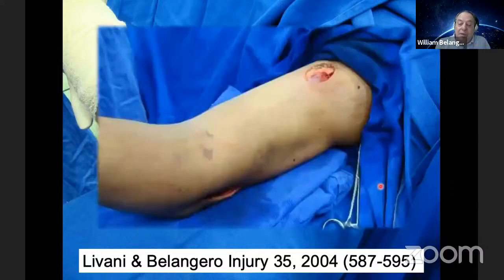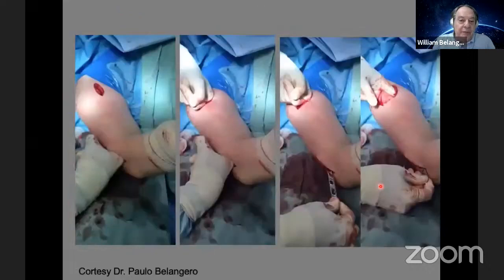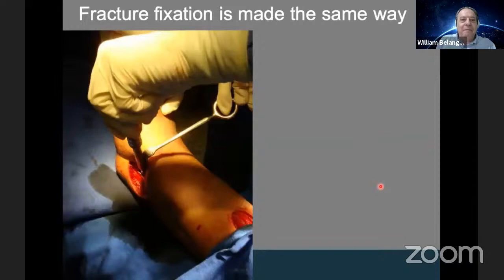This is the proximal approach, it's a conventional approach. The plate is introduced always from distal to proximal. Here. And you can use your finger to verify the safety of the humeral tunnel. This is a courtesy of my son. You see the finger in the distal approach, in the proximal approach. Then you can introduce the plate from distal to proximal, and to guide this introduction, use your finger, okay?